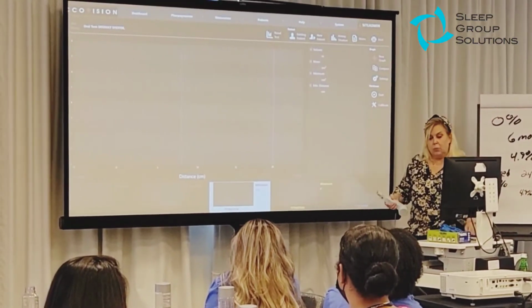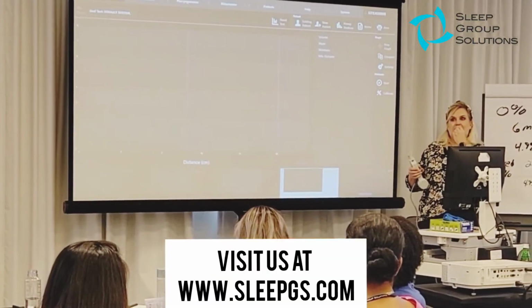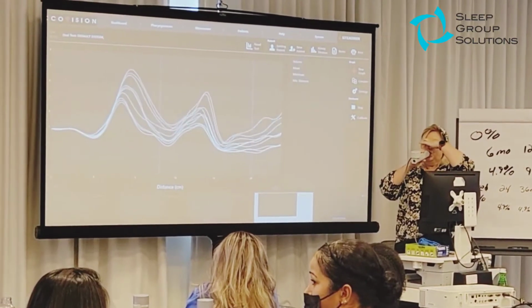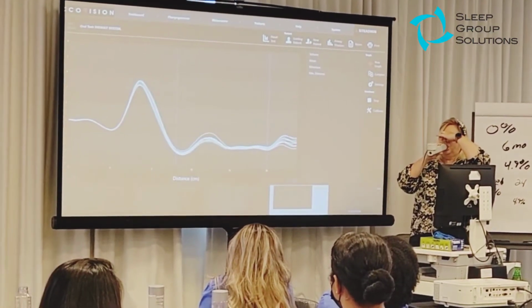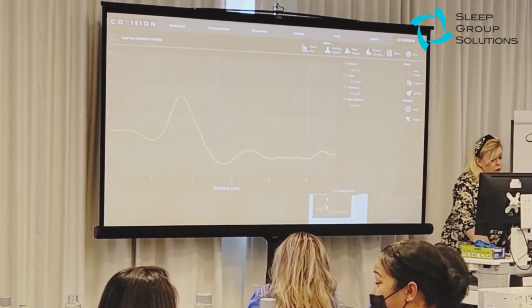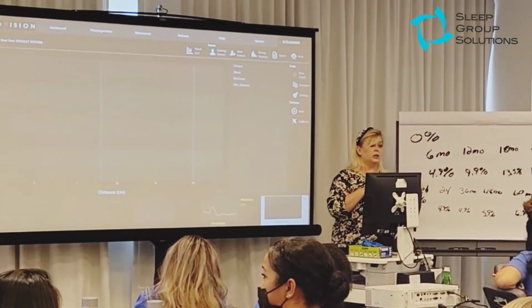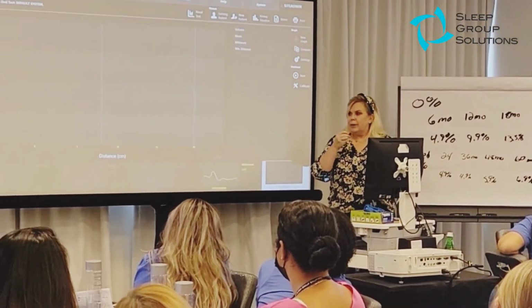So what you, no, go big or go home. So I'm going to do 8 millimeters of vertical. So here's 8. Still no protrusive at all. All right, that's a little bit better. A little bit better. Let's see if I can get better. Go bigger, go home. So here's 10 millimeters of vertical. Okay? And don't nut up. 10 millimeters vertical is only 3 millimeters in the back. It doesn't hurt. 10 millimeters in a patient is not uncomfortable. A lot of people think 10 millimeters. No, so that's 10 millimeters.